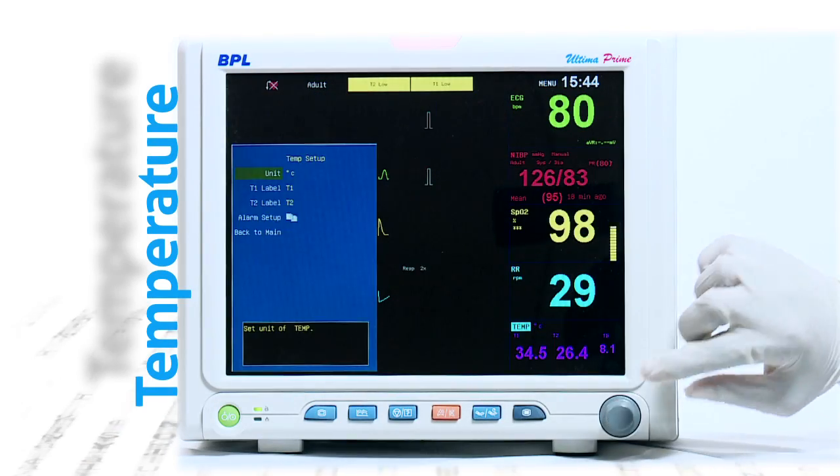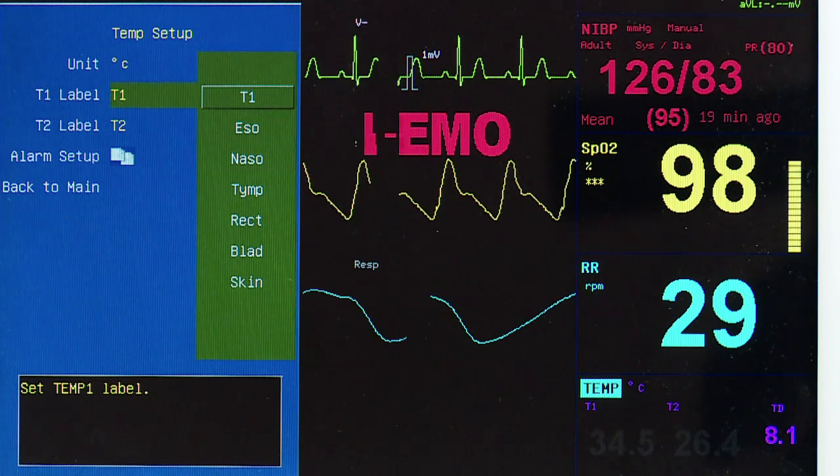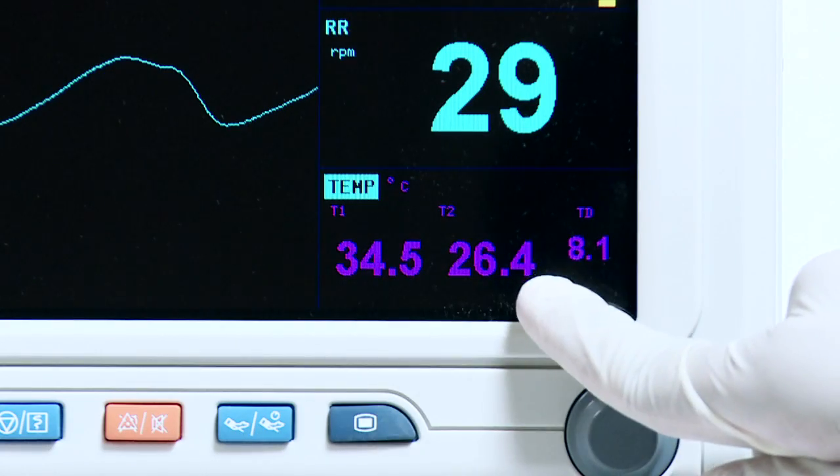Temperature is available as a standard feature on Ultima Prime, with dual temperature probes available for monitoring rectal and skin measurement sites, and measured values are provided on the screen.